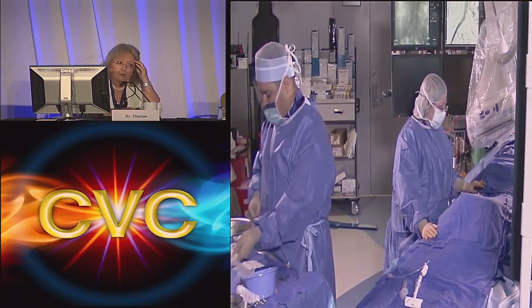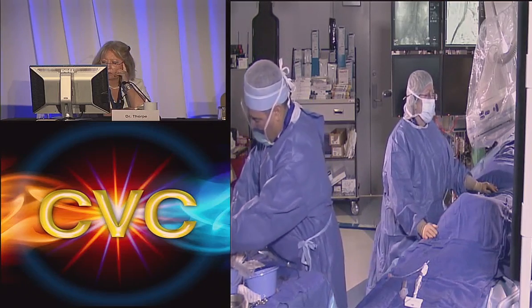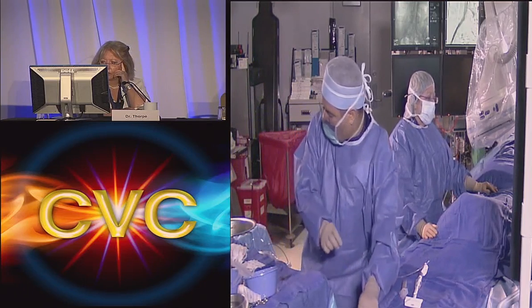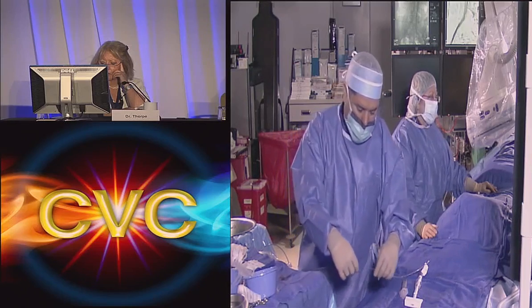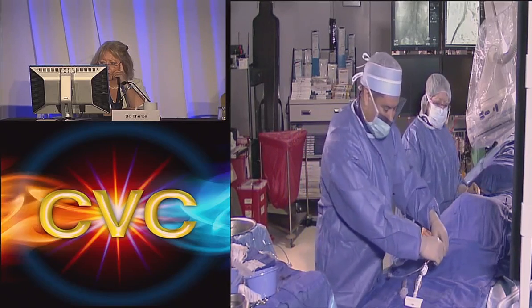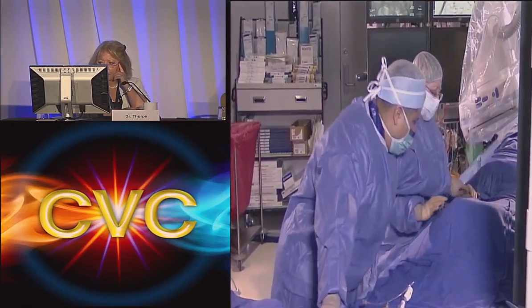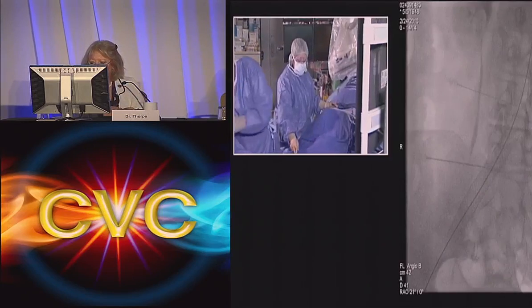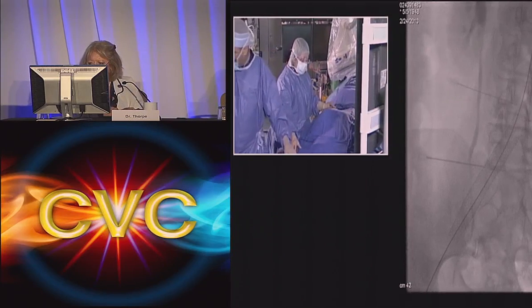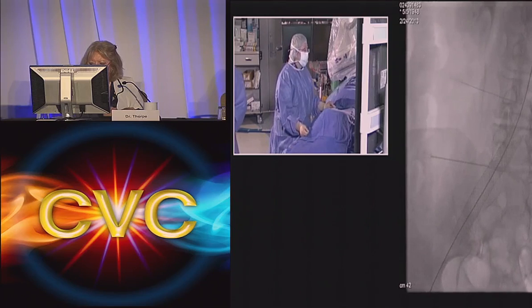So in this patient's case, you have to be careful about symptoms that are really related to a proximal obstruction, plus the accruance of some DVT that is residual in the tibial vein, so that affects her calf muscle pump. So we'll see how much relief she gets from opening up the proximal narrowing and high pressure. She does not have any reflux in her saphenous vein. She does, however, have reflux in her distal femoral and at the popliteal. And interestingly enough, she does not have deep reflux on the right side. So that's another clue that she had a left proximal obstruction.